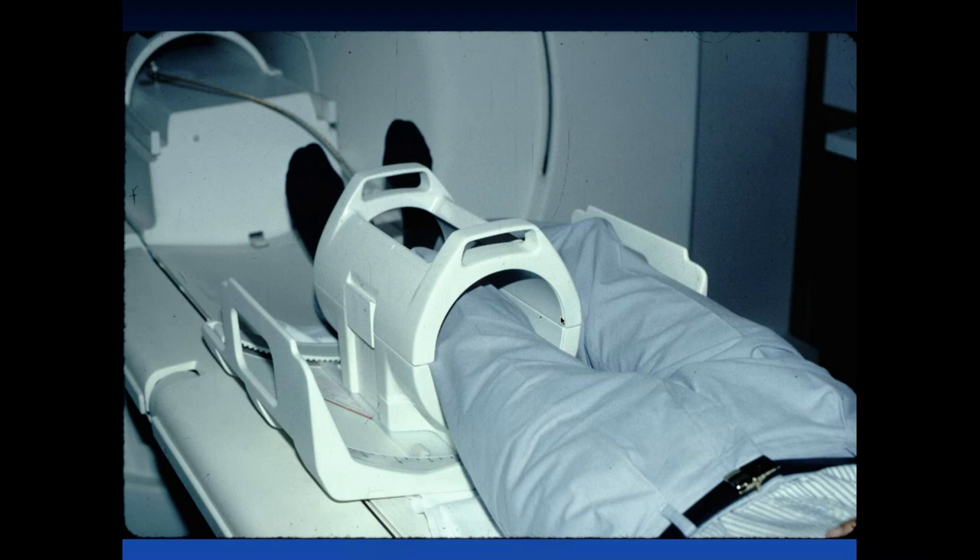The coil is very important in the musculoskeletal system. This is a very old knee coil from the early 1990s. In order to receive signal efficiently, you really want the coil placed close to the anatomic part. When you go out into practice, coil design will be important and will be at least as important as field strength in determining image quality.